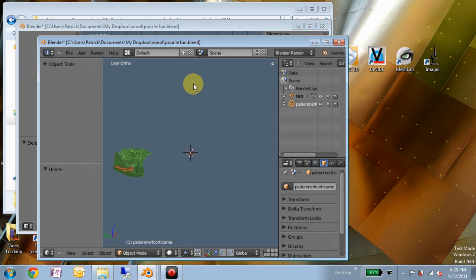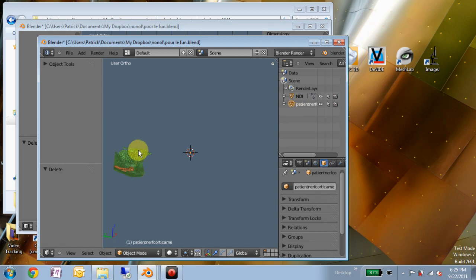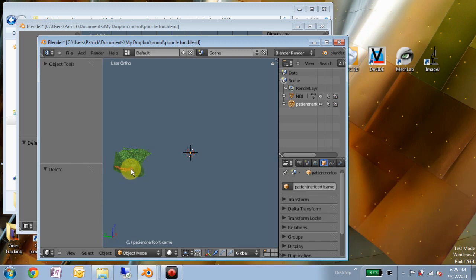So first I've opened up the pourlefons.blend, which is available in this folder that you've shared with me. I went ahead and deleted all the objects associated with the implants and just have the data from the CT scan, this surface representing a section of the mandible, and the inferior alveolar nerve canal.